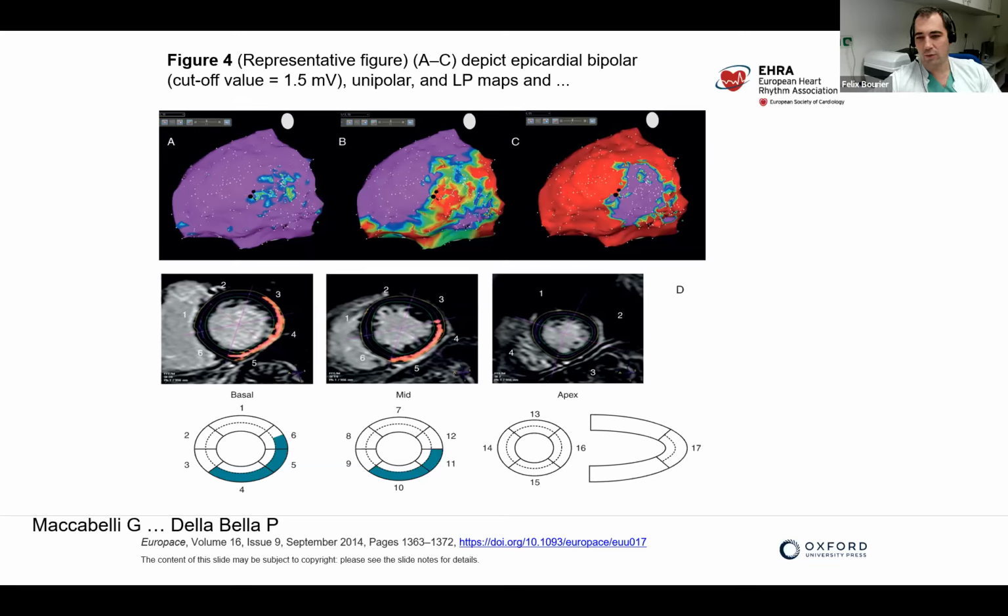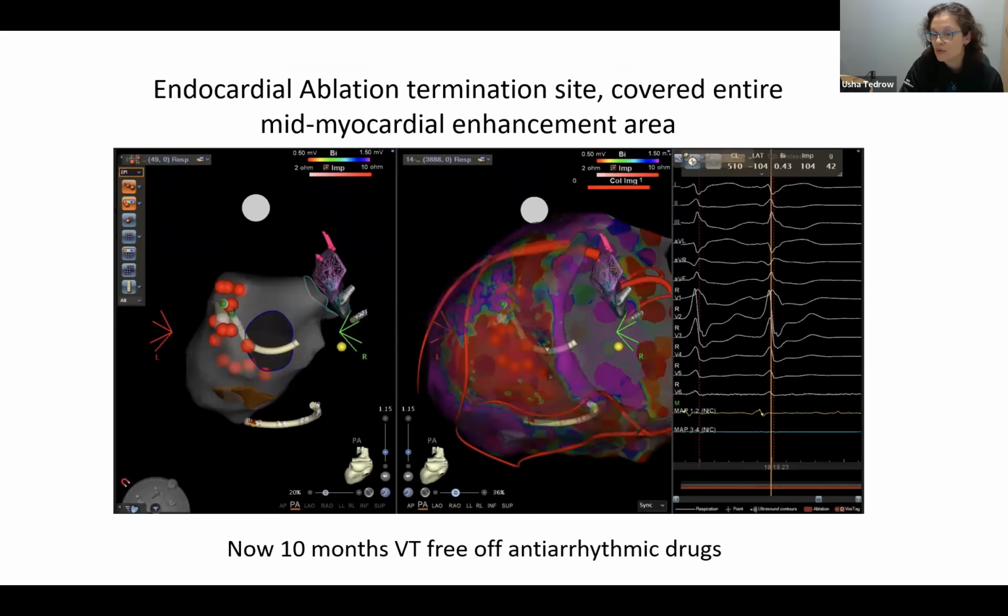If you do epicardial procedures, do you still see any need for performing a coronary angiogram or phrenic nerve pacing if you have the inHEART registration? So in this case, we didn't do it. I would say that it's not always the case. In this particular case, there was not much in the way of coronaries in the area that we were interested in ablating. And we felt like our registration was pretty good. We weren't going to be coming anywhere near the main ostia of the coronaries. What I would say is that when we do the ICE imaging, we know where the ostia are really well. And the proximal part of the coronaries is very reliable.